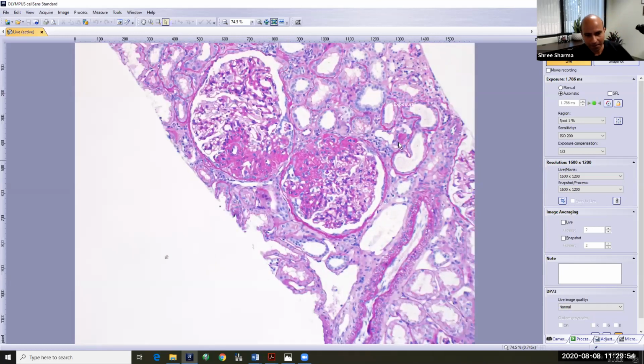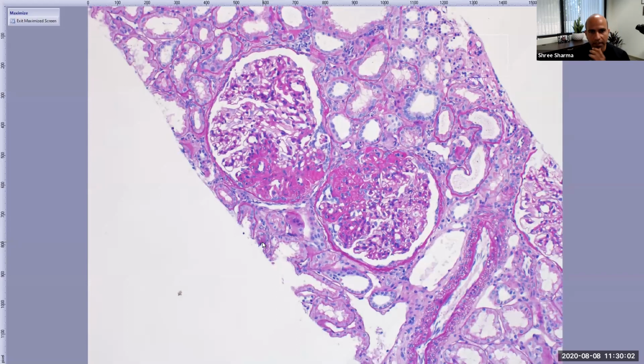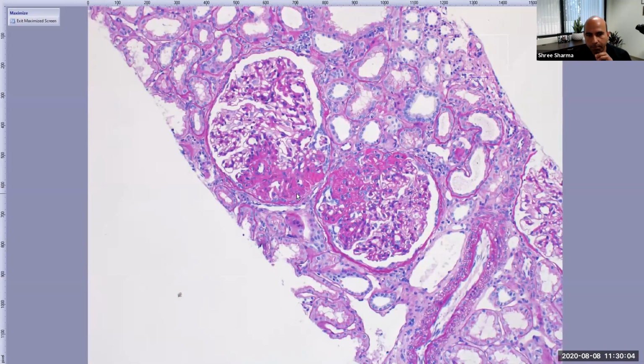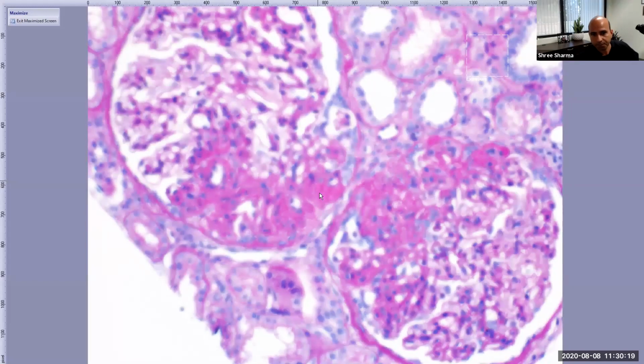So this is what you're mentioning, a lot of hyaline, right, in the subendothelial region. What does it mean? Basically, as I said, to start with, only a part of the tuft will be damaged. Only a few podocytes. Can you just show that one more time? What were you saying and point to where it is? Can you see the arrow? Yes. Okay, that is the hyaline he's mentioning. Hyaline, H-Y-A-L-I-N-E. And why do you call that hyaline?